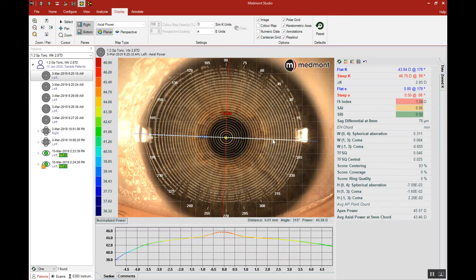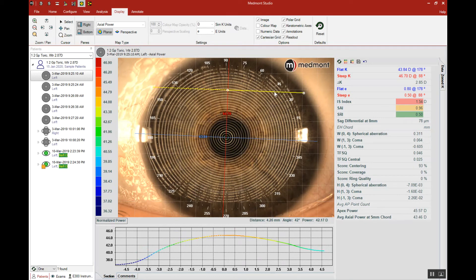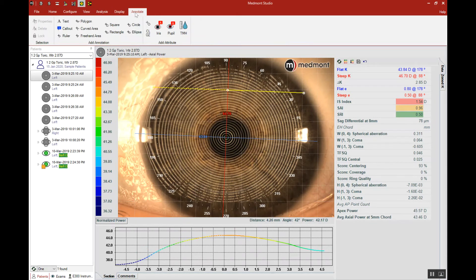We might pick up this axis line and move it out of the way so we have a clear view of the pupil itself. Then we'll go up to Annotate and select the pupil definition tool.